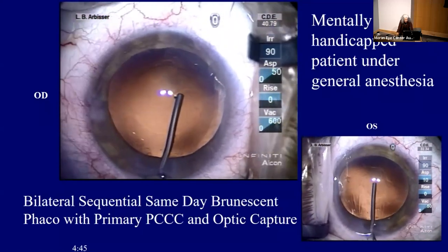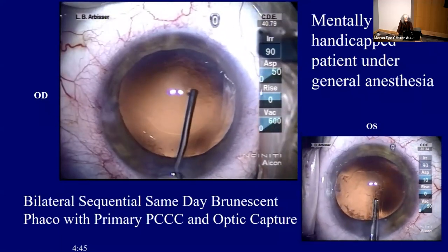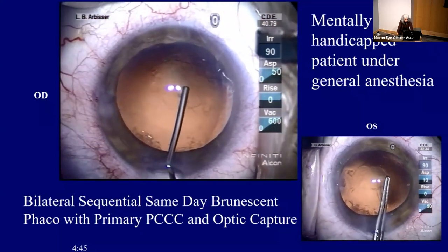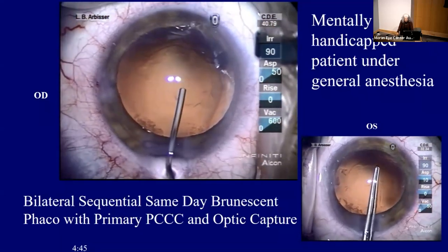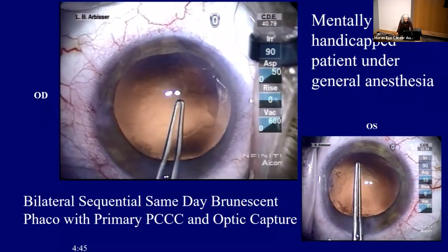And it's because we don't know where the anterior hyaloid is. It could be right behind it, or it could be a real space versus a potential space. Now I'm placing cohesive OVD through that tear in the opening of the posterior capsule, and it's pretty much filling into itself. I felt that I had enough done there.